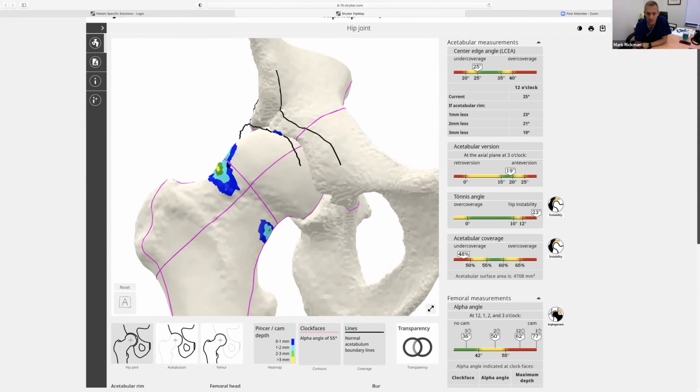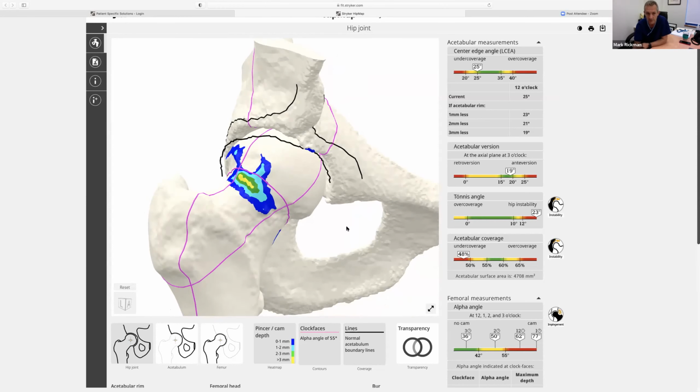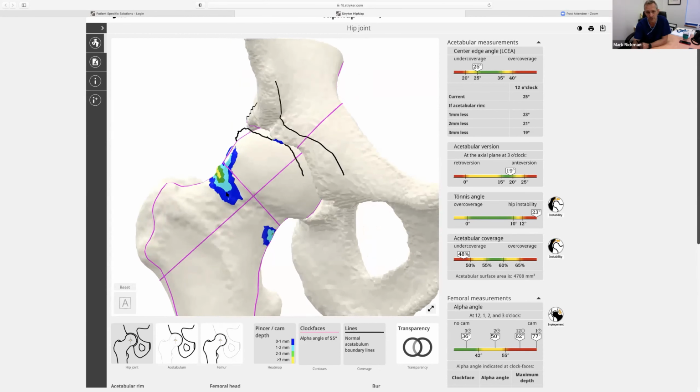And this is one of the problems with hip arthroscopy surgery: assessing what bone you take away and where you take it from is really difficult. And we use x-rays intraoperatively. And you try and sort of take away as much as you can, but at the same time, you don't want to massively overdo it. And we've all seen x-rays or scans afterwards with a huge, great divot taken out of the superior neck.